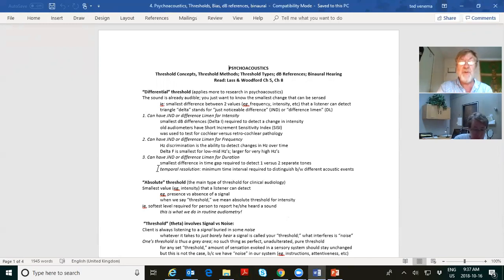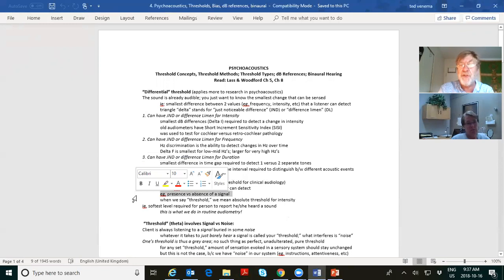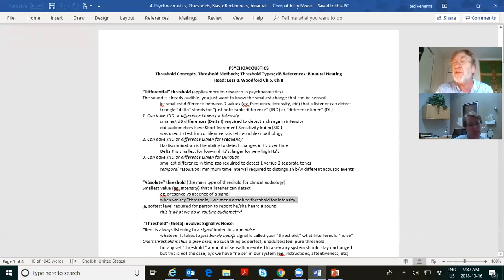So read with me. Absolute threshold, the main type of threshold we use. What's the smallest value that you can hear? Presence versus absence. When we say threshold, we mean absolute threshold for intensity. So on the audiogram, when you put headphones on someone and the person's raising a finger or pushing a button to let you know he or she heard, that's called absolute threshold testing. So it's the softest level required for a person to report that he or she heard a sound. This is what we do in routine audiometry.